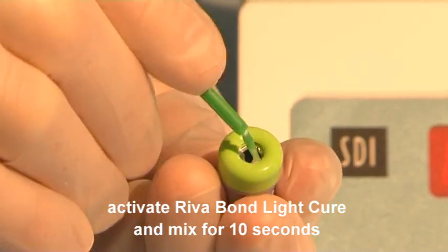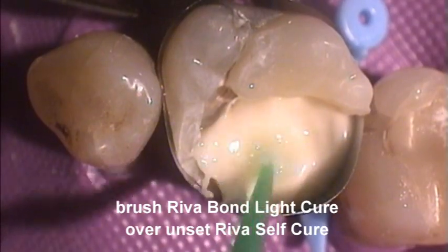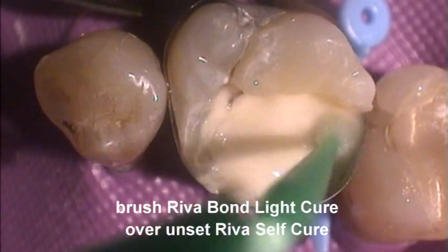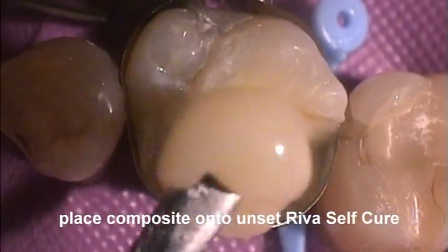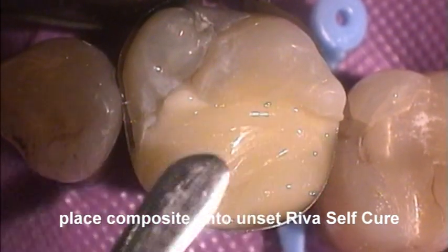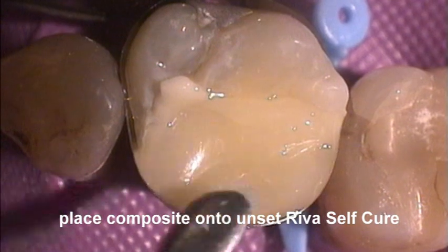Impregnate the bond into the brush and commence condensing the glass ionomer cement. Prior to setting of the Reva SC, place a suitable composite resin into the preparation and condense the cavity to slightly overfill the preparation.